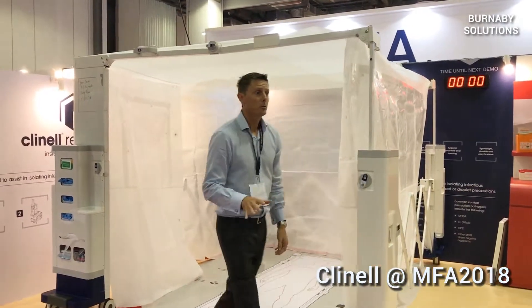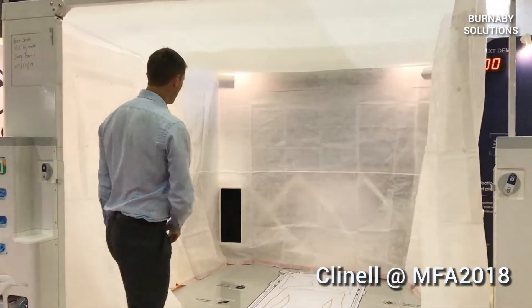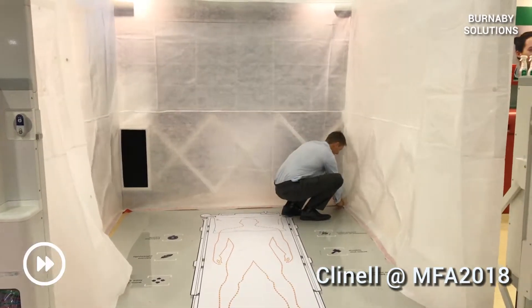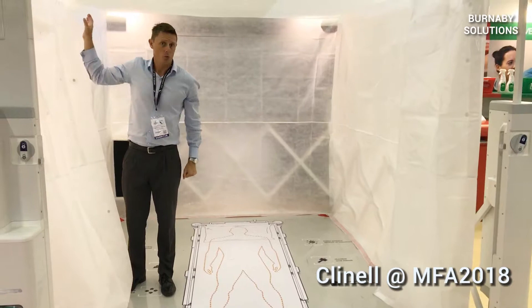Now what I expect to do is to attach the walls to the floor, starting with each corner to make the walls straight. And I'll attach the doors as well.